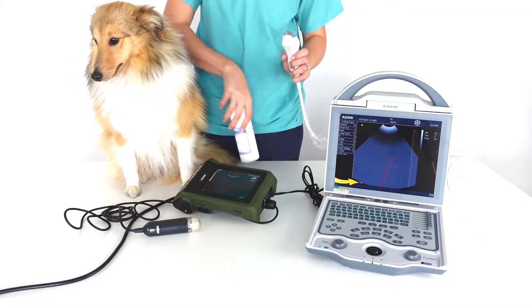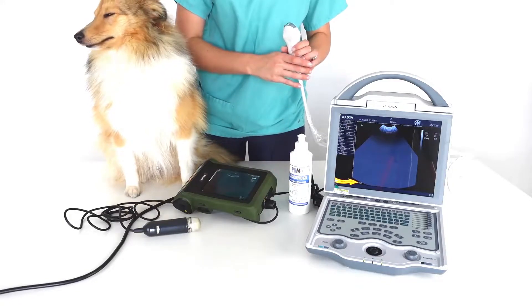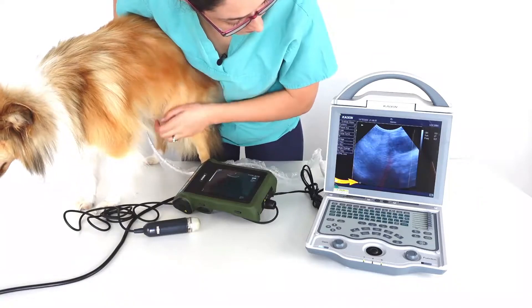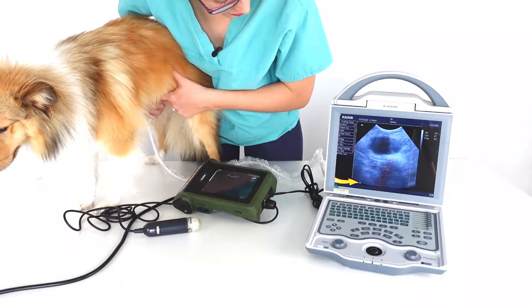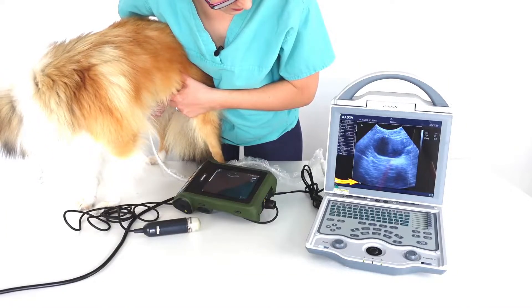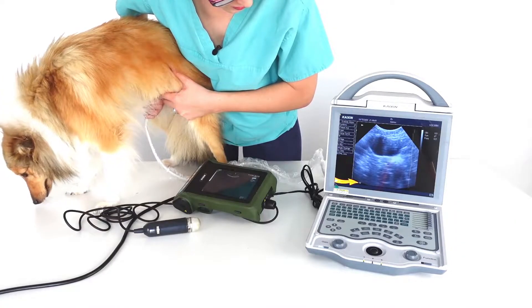Here's a quick comparison between an electronic ultrasound machine and a mechanical sector ultrasound machine. If you were performing a pregnancy scan on a dog, the first thing you would look for would be the bladder. So that's how it appears on an electronic scanner — I'm just going to freeze that image.